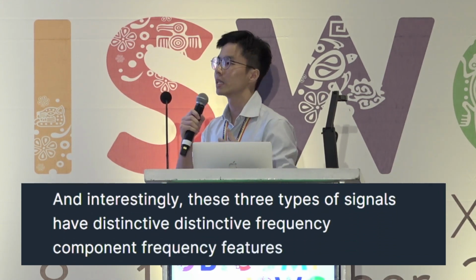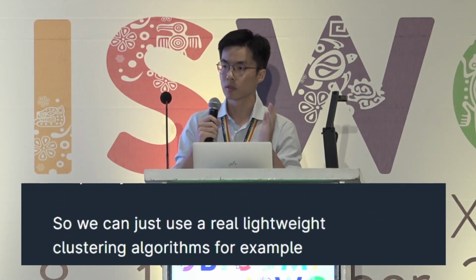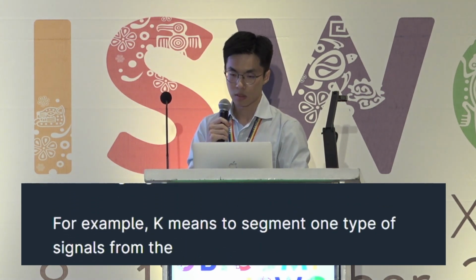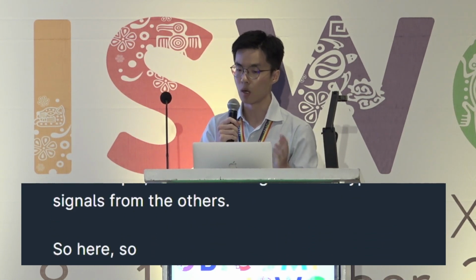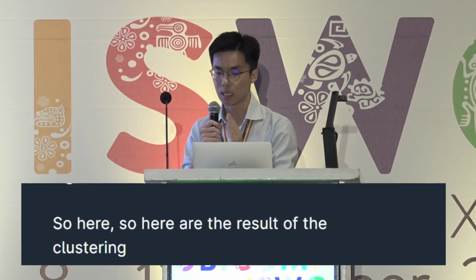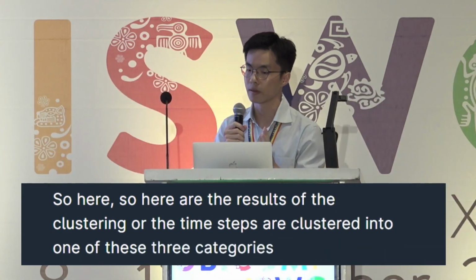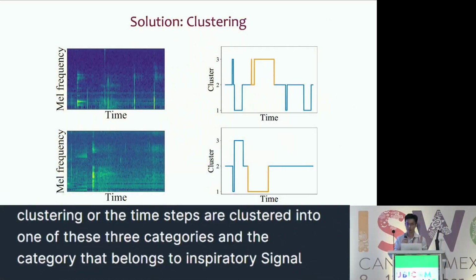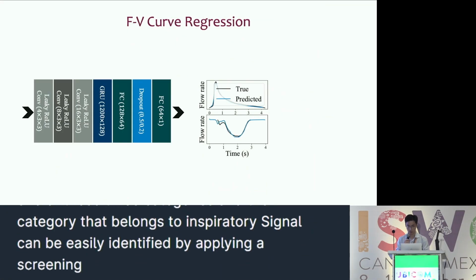So we can just use a really lightweight clustering algorithm, for example, k-means, to segment one type of signal from the others. So here are the results of the clustering. All the time steps are clustered into one of these 3 categories. And the category that belongs to inspiratory signal can be easily identified by applying a screening criterion.